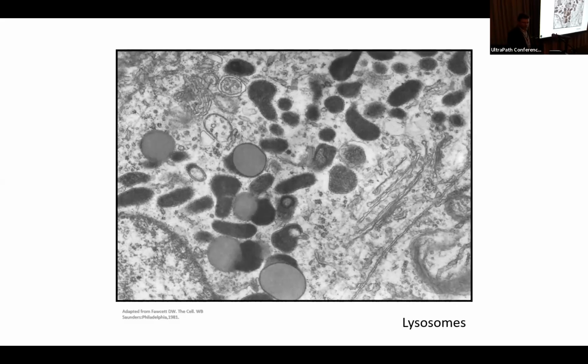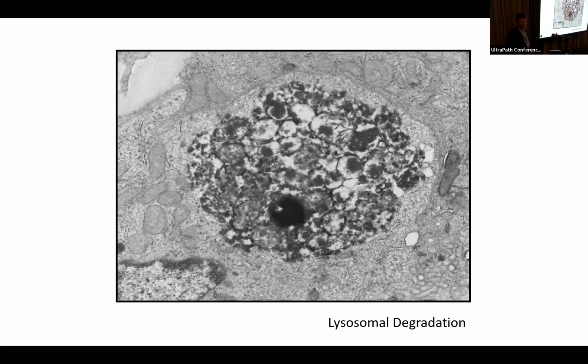And then produced by the Golgi complex, which can be seen again over there to the right, are lysosomal granules, which provide the cell's waste disposal and recycling mechanisms. We're going to be devoting an entire session to what can go wrong when these lysosomes go awry, so we won't talk about that too much.